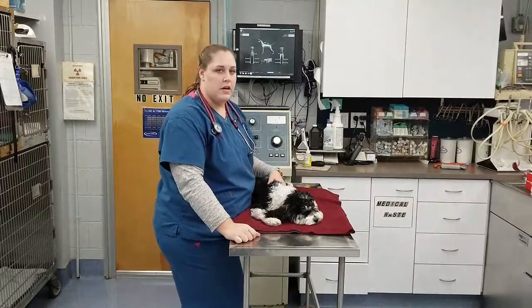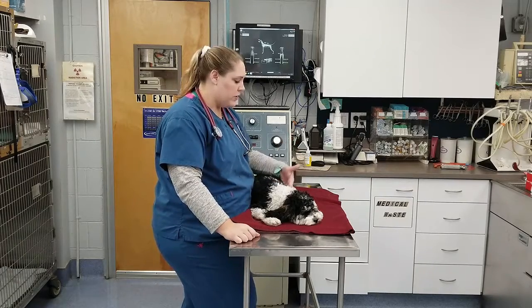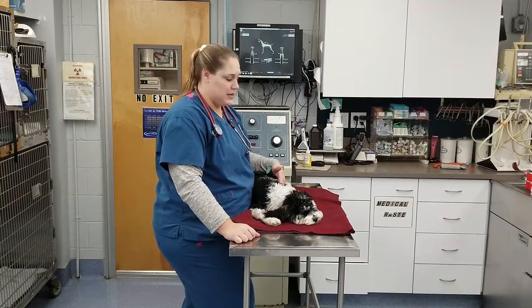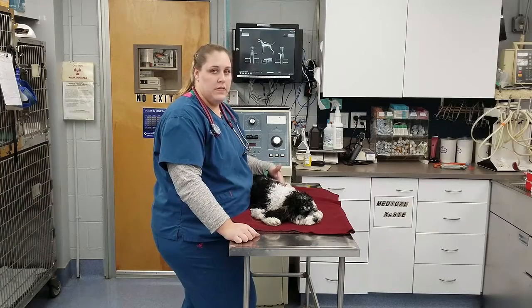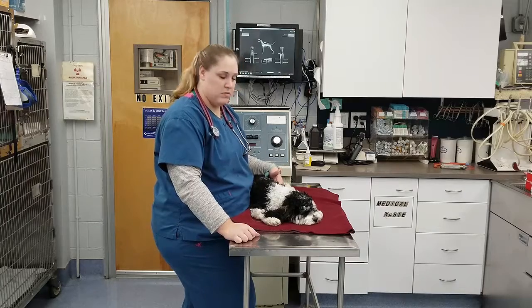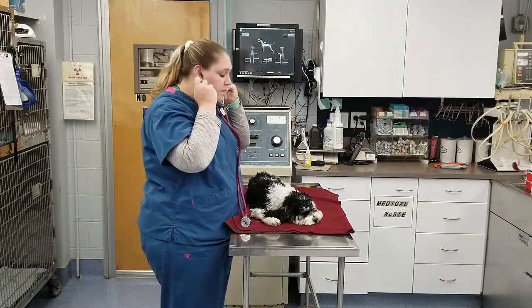To auscultate the heart and lungs of a canine patient, first, to listen to the heart, we're going to listen to the left side of the chest, and you want to listen for where it's the loudest, usually right about the point of the elbow on the left-hand side. If we're counting rate, we're going to listen for 10 seconds, and then multiply that number by 6. I'm just going to take a listen, and then we're going to count the beats that we hear.